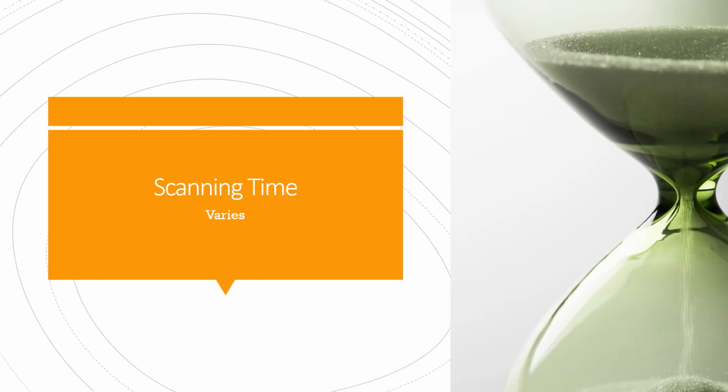Scanning time varies between every machine or every system. It can range from 3 to 8 minutes, and I would even say it's going to be dependent on the patient and the intraoral structures. If those teeth are tipped, if you have any mesial drifting, if you have any missing teeth, if you have a patient who can't open as wide, it's going to take you a little bit longer to scan than it would with someone who has perfectly straight teeth in that arch.